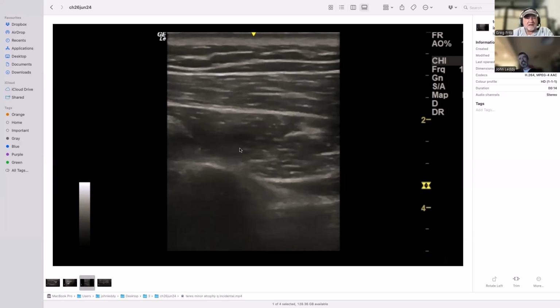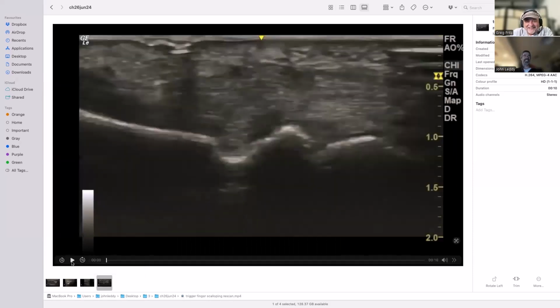You certainly could say it the other way around, that the teres minor goes up when infraspinatus goes wimpy. Not in every case, but in quite a lot of times you look at it and you go, oh, infraspinatus is really wasted. Oh, teres minor is how brilliant! That's fabulous. That's what you'd like to say from a well-run machine.